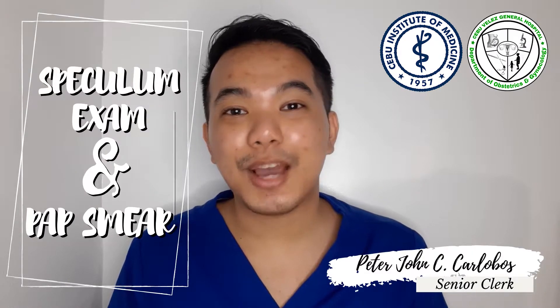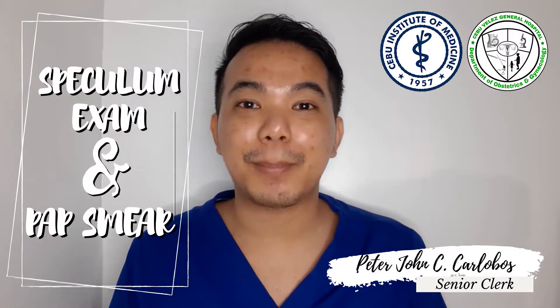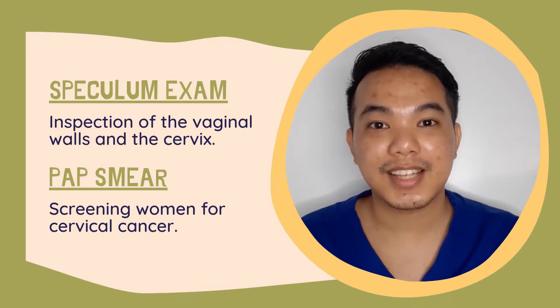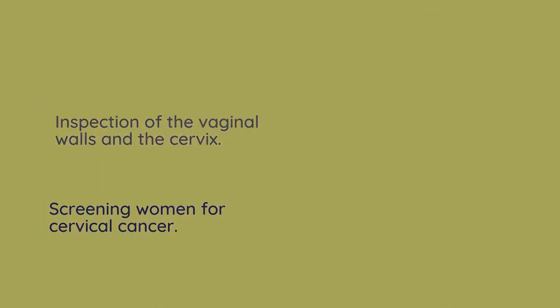Hi, I'm Peter Karlobos and I will be showing you how to perform a speculum exam and taking specimen for the Papanicolaou smear. The speculum exam is done to inspect the vaginal walls and the cervix. The pap smear, on the other hand, is used to screen women for cervical cancer.